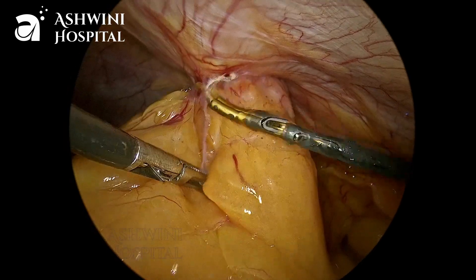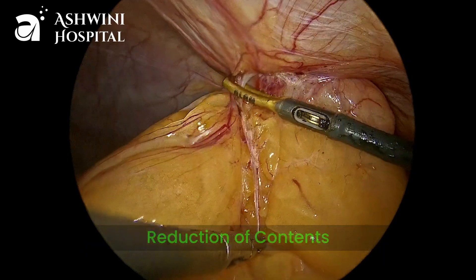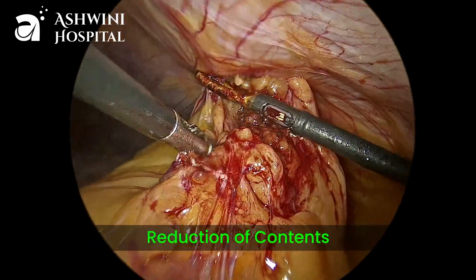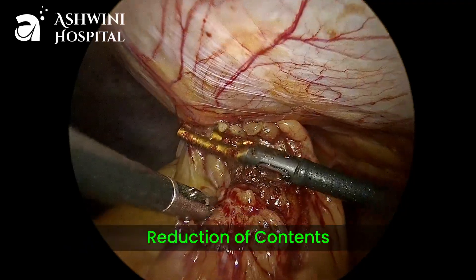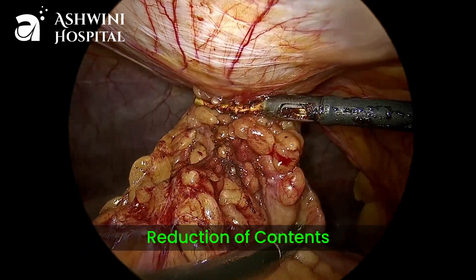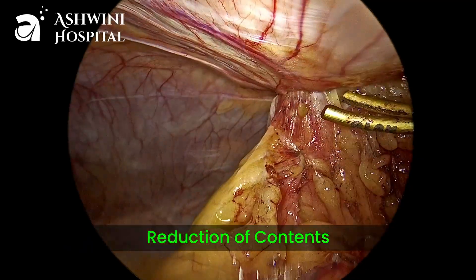As this is a long-standing case, we can expect a lot of adhesions between the omentum and the sac. By giving constant traction with the left hand and slowly releasing the adhesions, the content will slowly come out from the hernia sac.